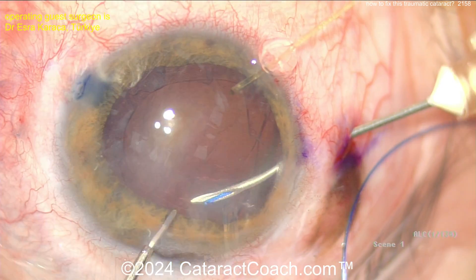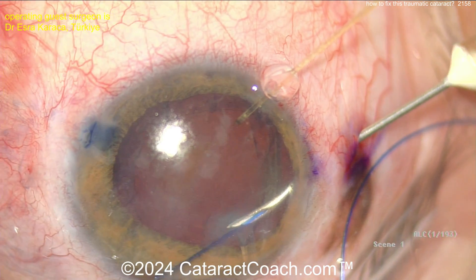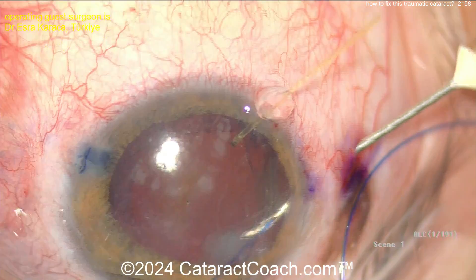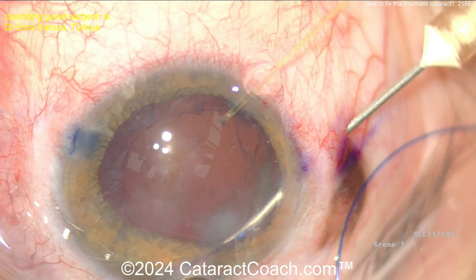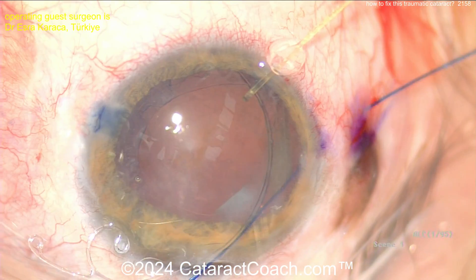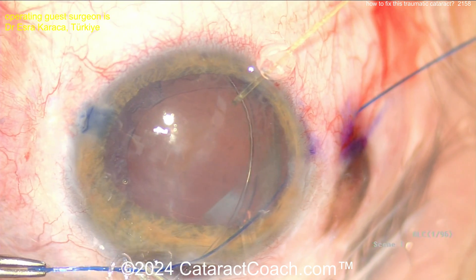That's going to go through the eyelet of a Cionni ring. So let's pull that through — there it is. You can probably get the needle out of the eye now. So now you've got a suture here, putting it through the eyelet of the Cionni ring.